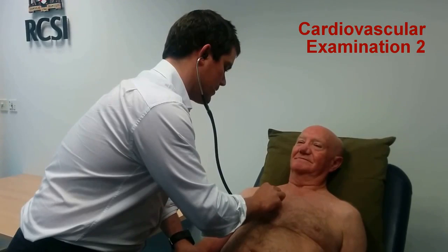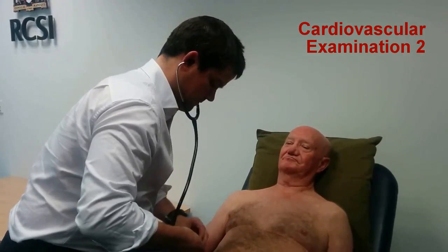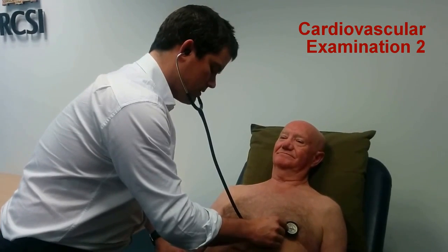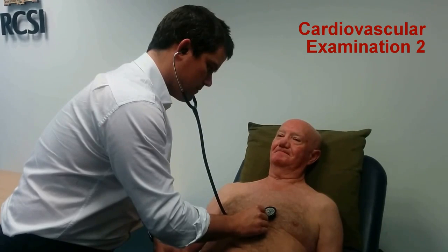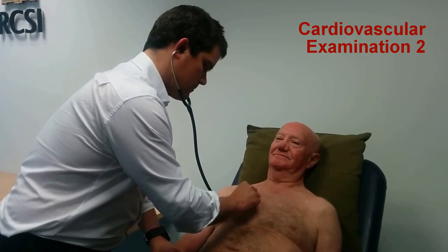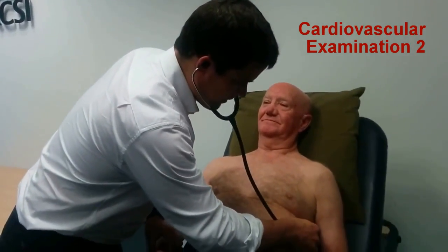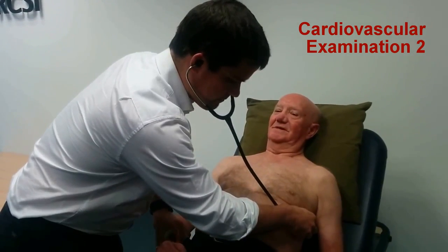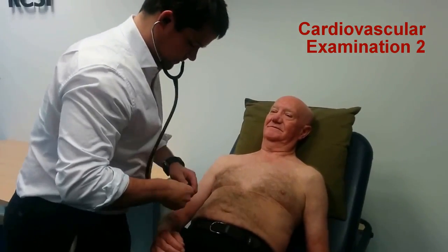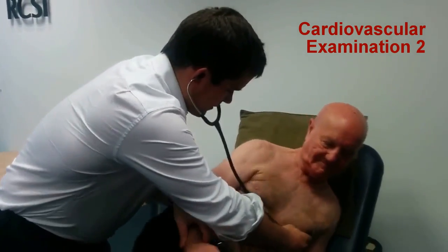And breathe normally and keep still. And hold your breath. Let's move the bell into four areas. Take a big breath in and a big breath out. Can I get you to roll onto your left side? Just like that, that's great.